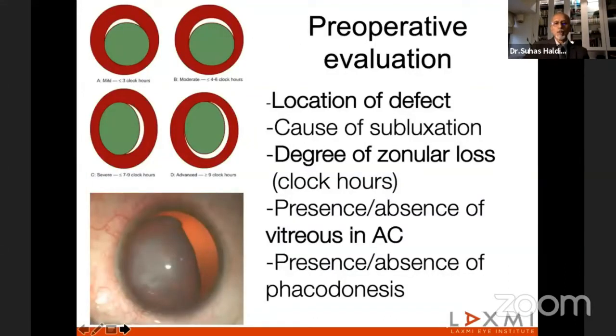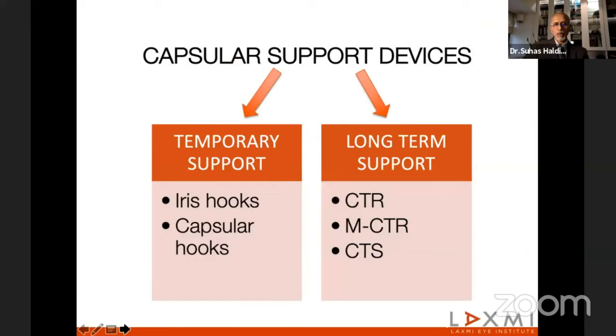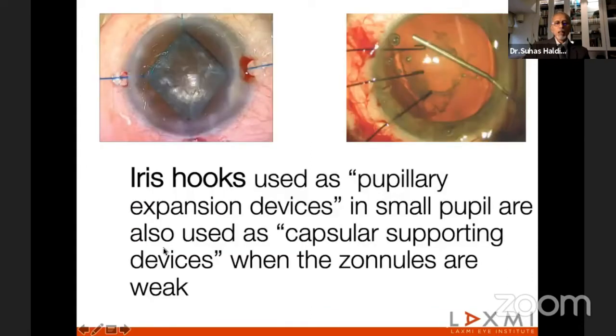Pre-operative evaluation is very important. The location of the defect, degree of zonular loss, vitreous in the AC, and presence or absence of phacodonesis is important. Obviously, we need capsular supporting devices. There are temporary ones and long-term ones. So iris hooks used as pupillary expansion devices in small pupils are also used as capsule supporting devices when the zonules are weak.